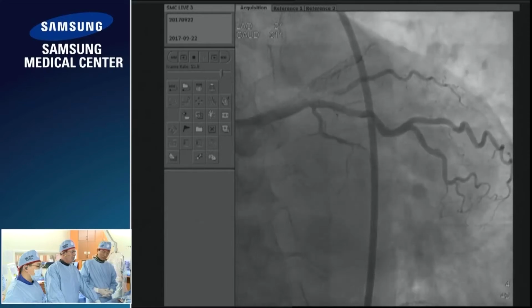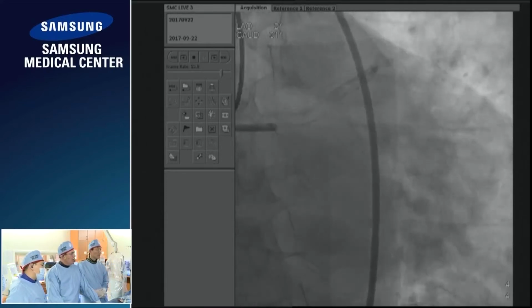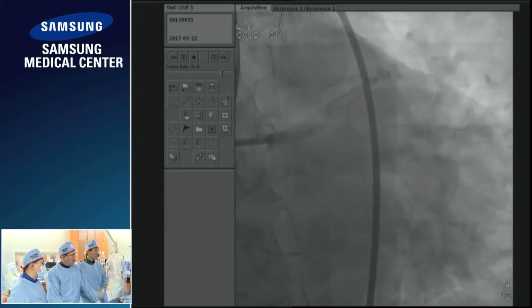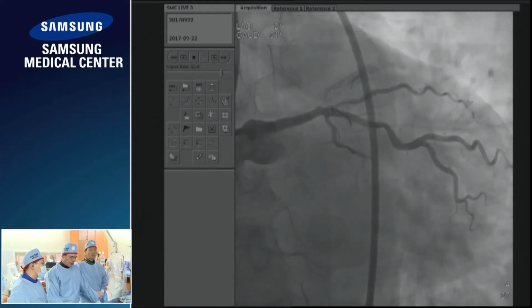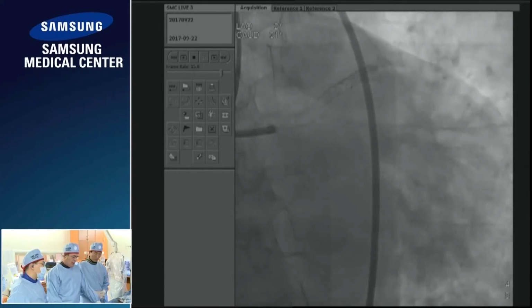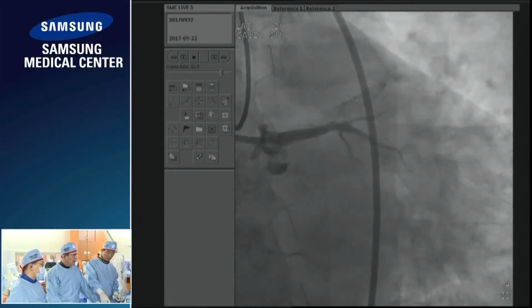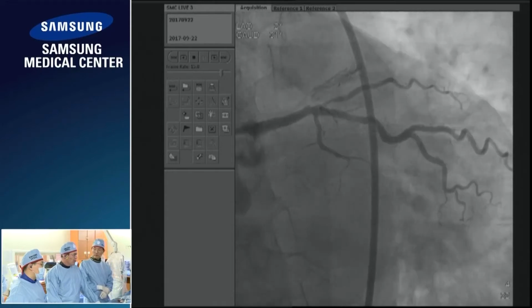Well, from the views that we can see here, the occlusion point was actually proximal to the stent. I think there was really heavy plaque burden, and we can see that now in this segment proximal to the stent. Whether or not this was generated by an edge effect with the original stent, certainly I think there's been progression of the proximal plaque.